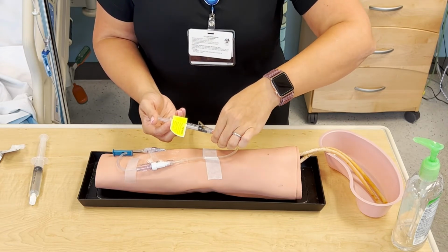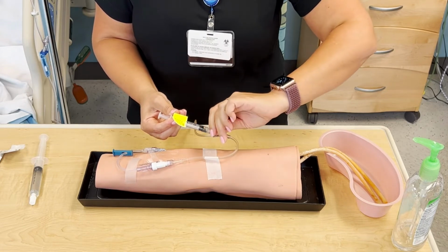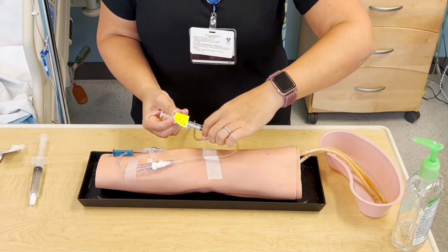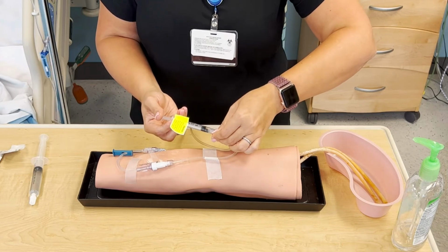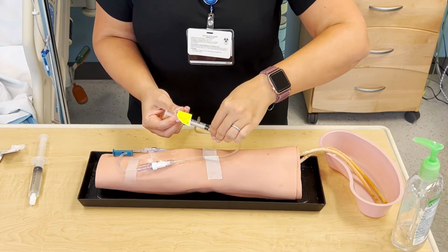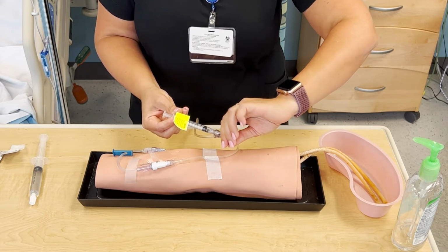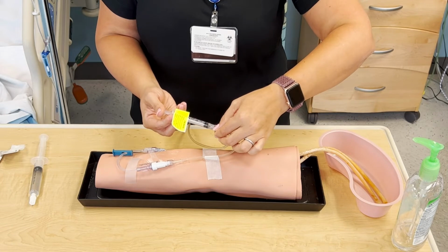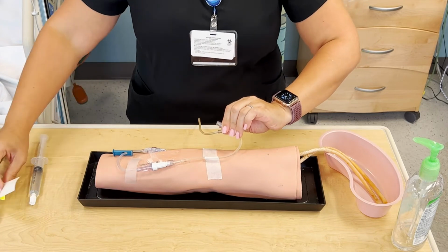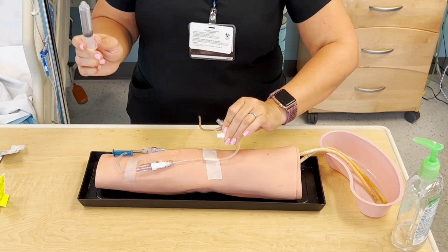And then pinch, give 0.25 milliliters again. And wait for 15 seconds to elapse. Pinch. Another quarter has been given. And the rest will go in. And let it go, maintaining your hold on the tubing. We will switch to our flush.